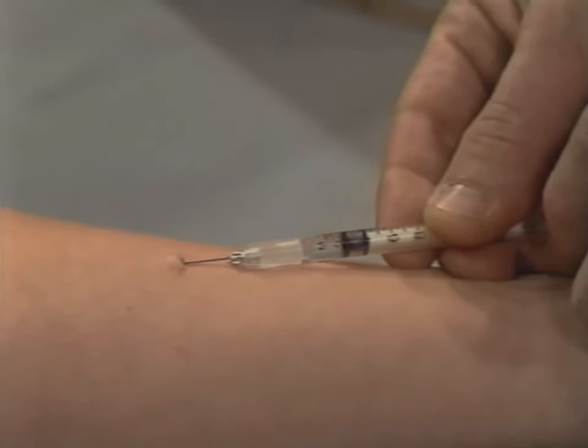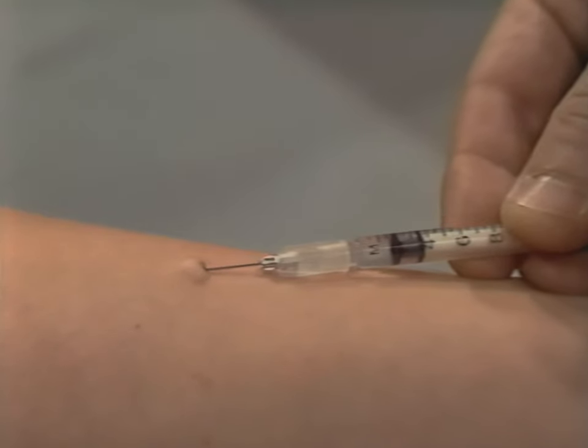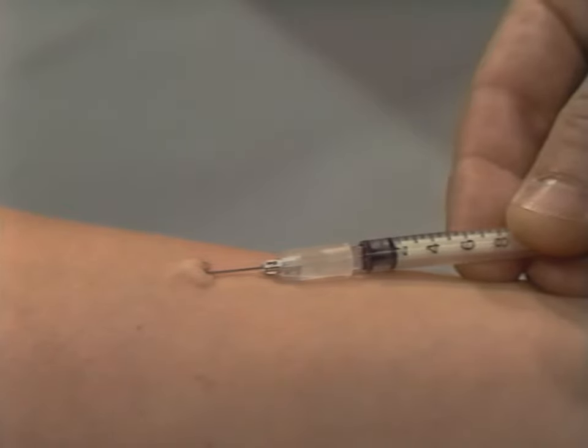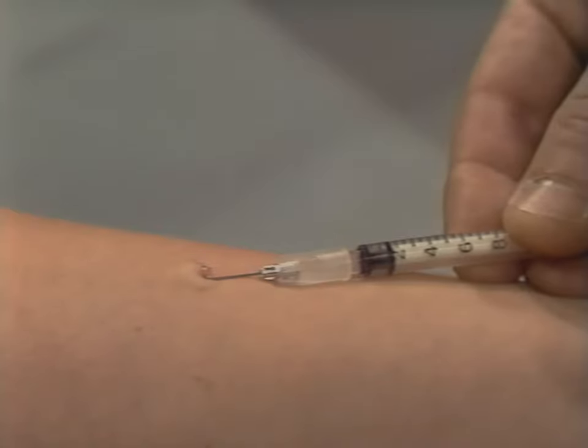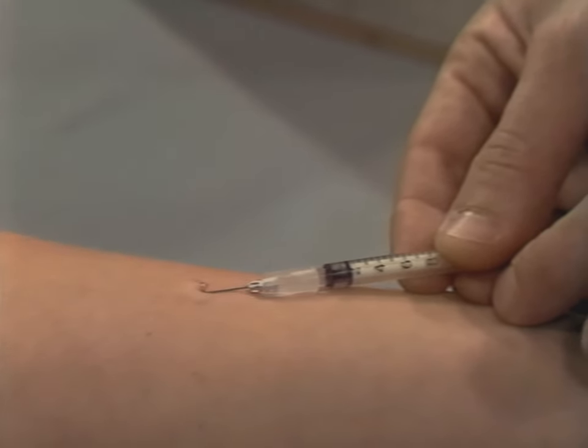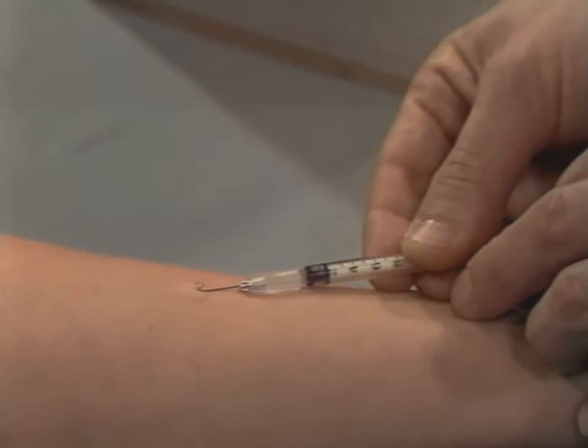Inject a small amount of solution. If you have inserted the needle correctly, a small, white, circular bump will appear on the skin. Inject the remainder of the solution slowly. The small amount of solution you ordinarily inject will remain in the circular bump under the skin.